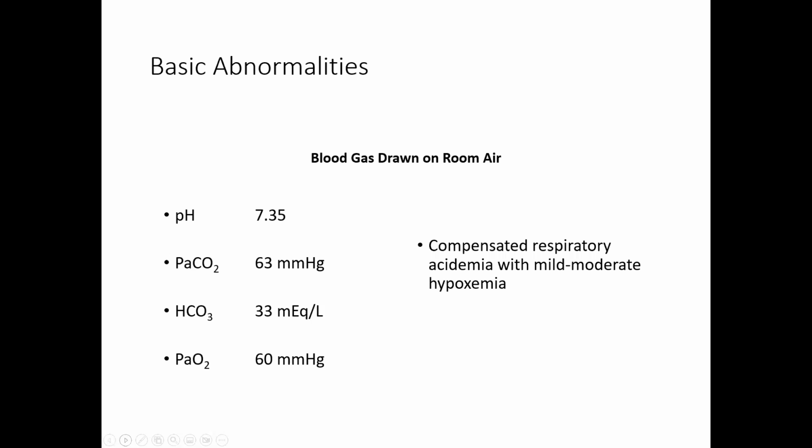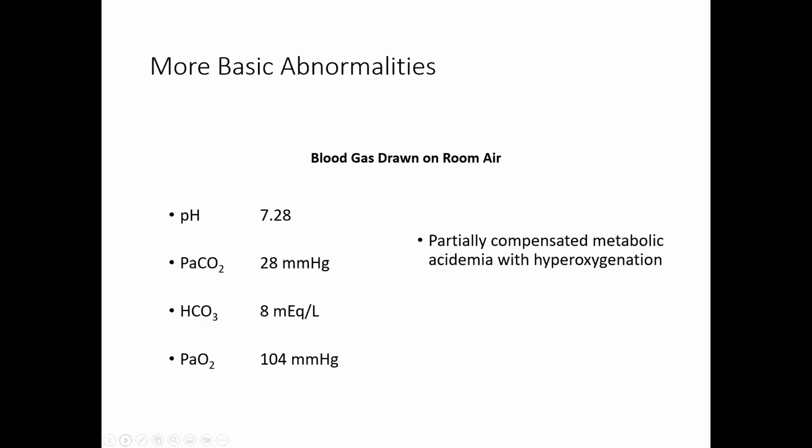Again, normal pH, PaCO2 is elevated, but so is the bicarb, so this is a fully compensated respiratory acidosis with moderate hypoxemia.